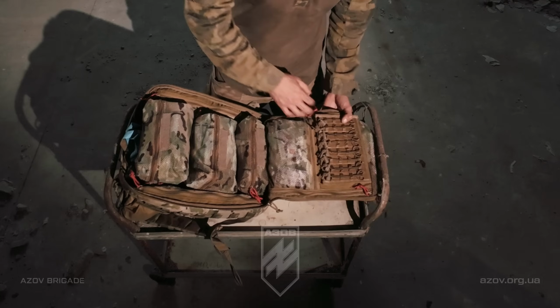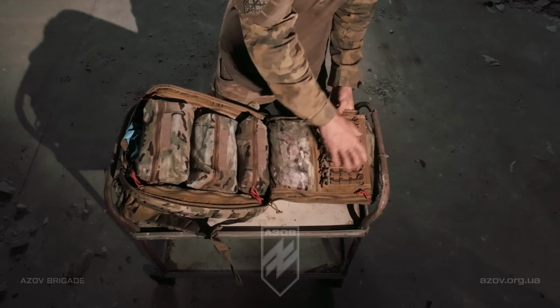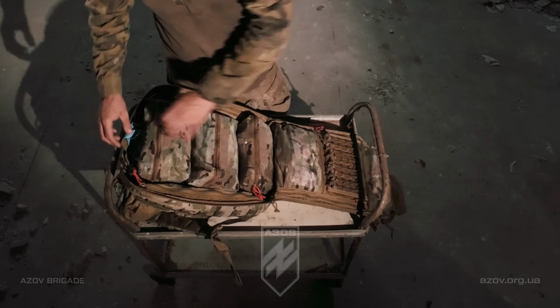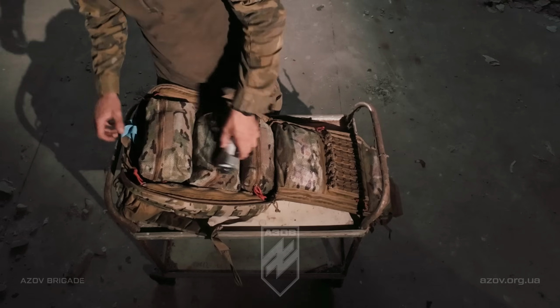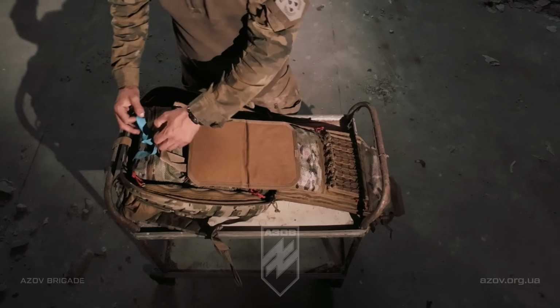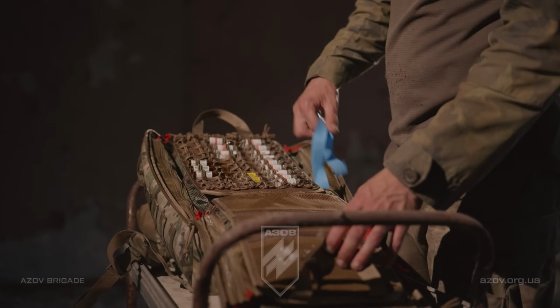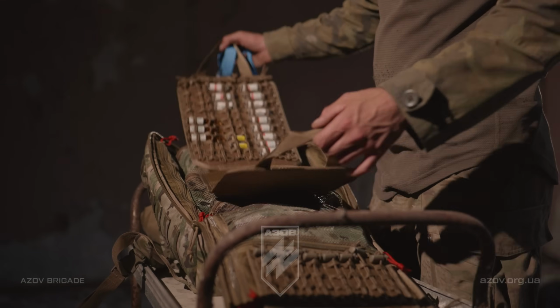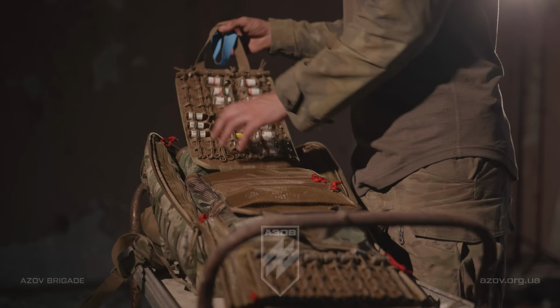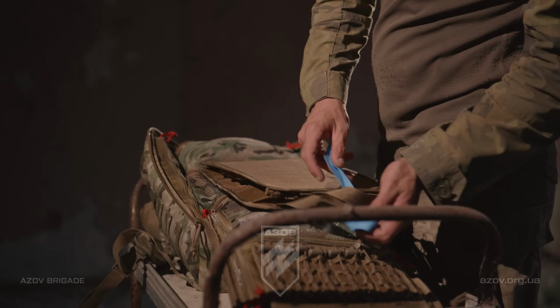On the front here, you're going to see this little Velcro attachment. That's the way you want to keep ampules if you want them at hand. Or you can use this, which is like a pull-out medicine drawer. On here, you're going to see the TXA, ketamine, ondansetron. Your antibiotics are here. You've also got room for your needles you're going to draw through, maybe some saline. You can put your casualty cards in there as well.